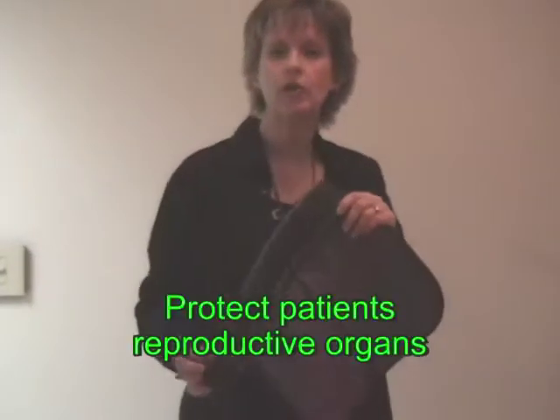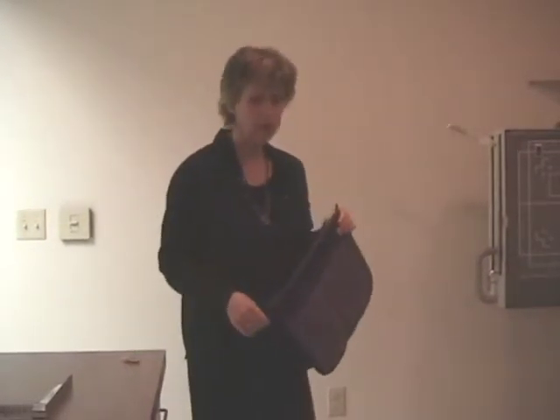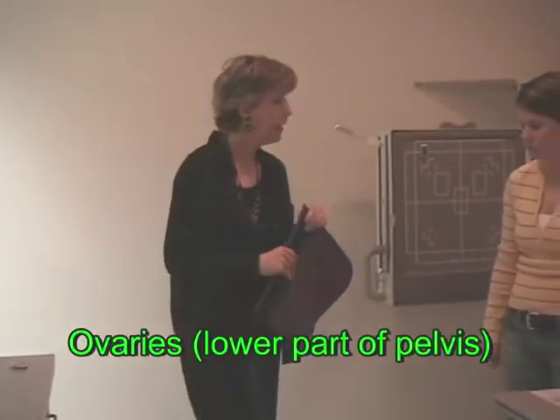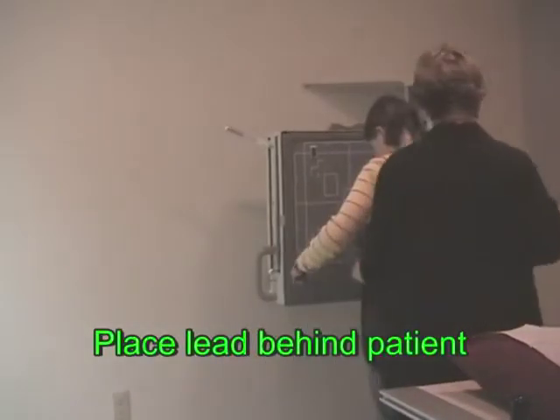We need to protect our patient's reproductive organs. She's definitely under the age of 40. Female reproductive organs are the ovaries. They're the lower part of the pelvis. And she's going to be facing the wall bucky, so I'm going to put the lead behind her.